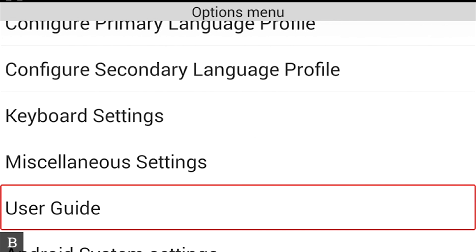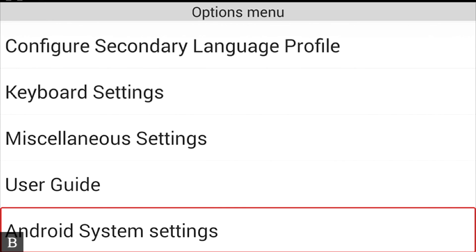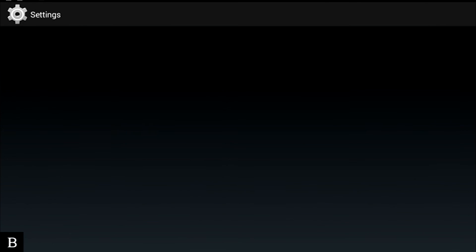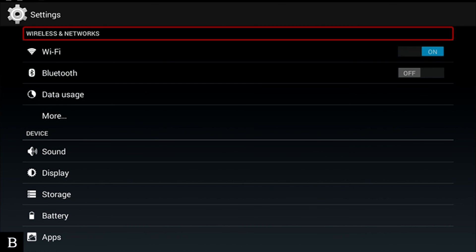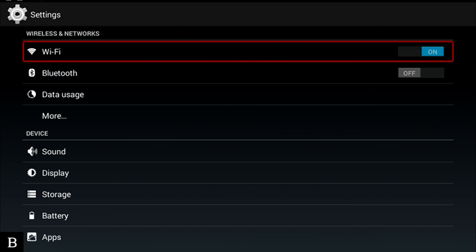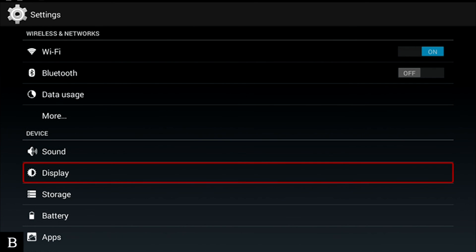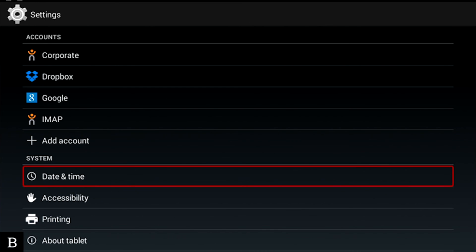The User Guide is directly accessible from the options menu, so you can go in and read it at any time. Android System Settings is a bridge to the Android settings, where you can set up wireless, Bluetooth, configure accounts, date and time, and more — all using a Keysoft-style approach. And remember, all of this is first letter navigable: I can press D to jump to Data Usage, Display, Dropbox, or Date and Time in the Android settings, even though it's an Android application.